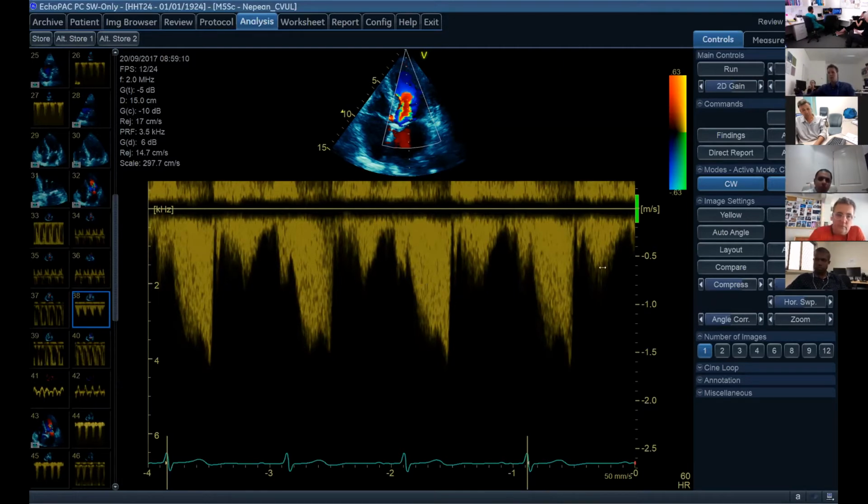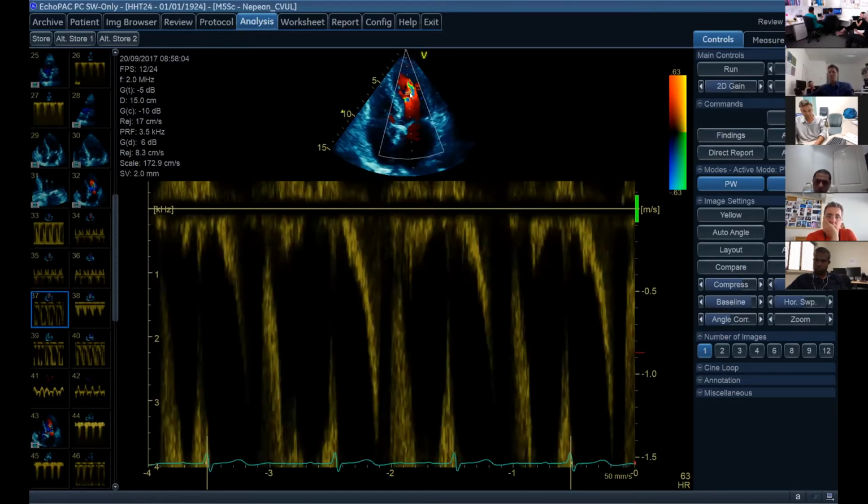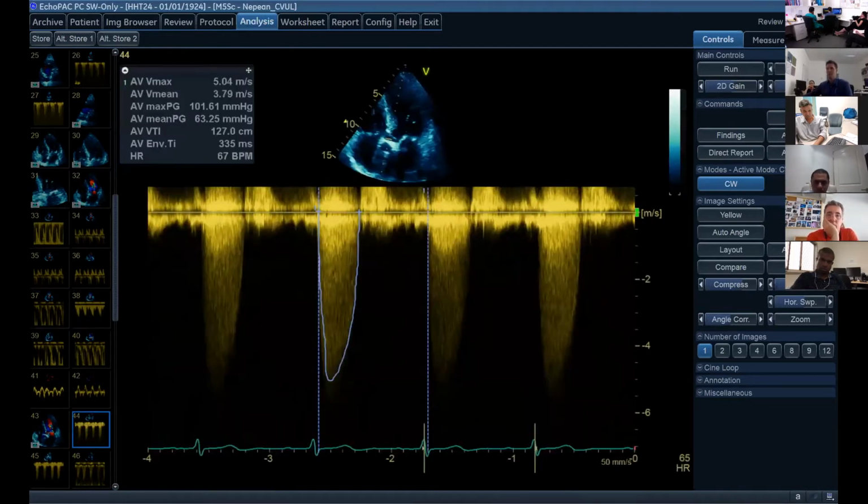And that's what this represents, in terms of meters per second, that hose pipe of water gets faster and faster and goes further and further, and then suddenly stops off because you've got complete occlusion, and then the speed drops off completely. And that tells me that we've got some form of obstruction during systole, and as that ventricle is contracting down, because I've got my pulse wave in the middle of the ventricle, it eventually stops flow because of the complete obstruction, the mid-ventricular obstruction, as Ramsey was saying. Yep. All right, Ramsey. So what do you make of that then?